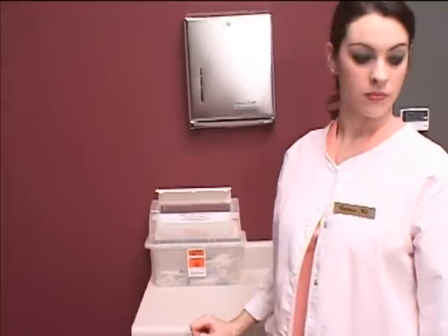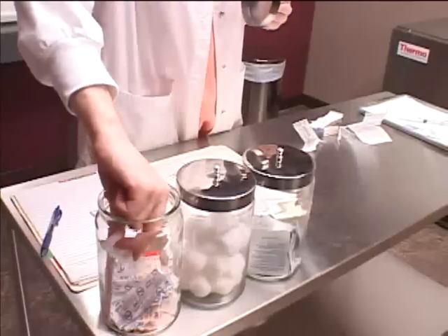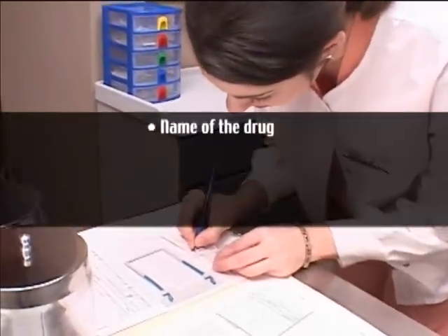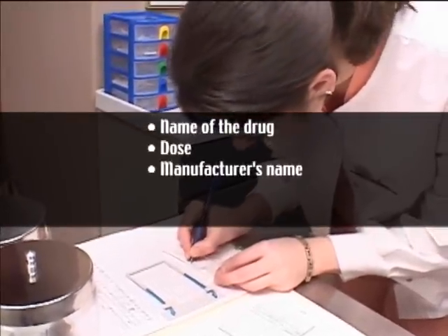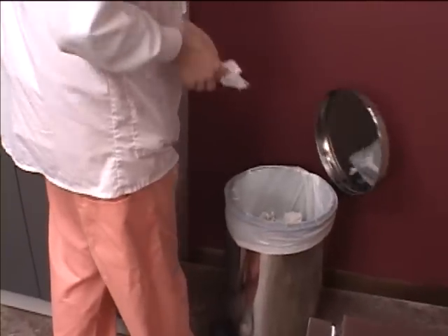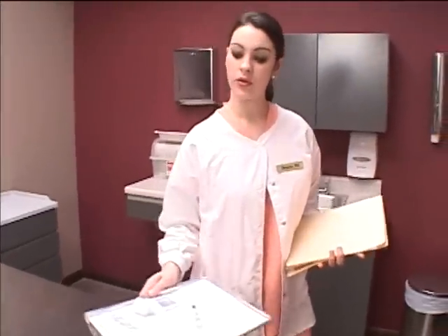in the sharps container. Set up a cotton ball, alcohol pad, and adhesive bandage. Label the syringe wrapper with the name of the drug, dose, manufacturer's name, lot number, and expiration date. Dispose of your trash and wash your hands. Pick up the medication tray and leave.